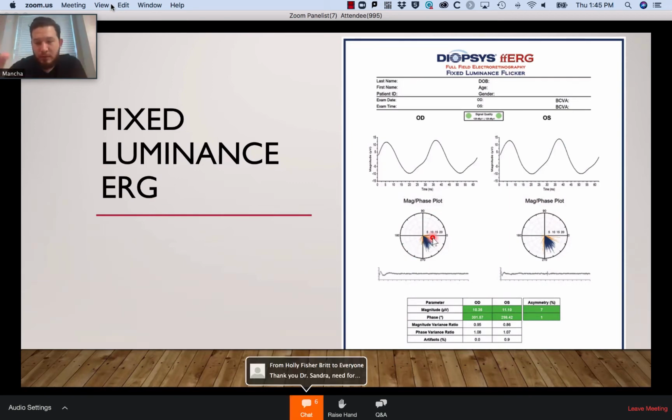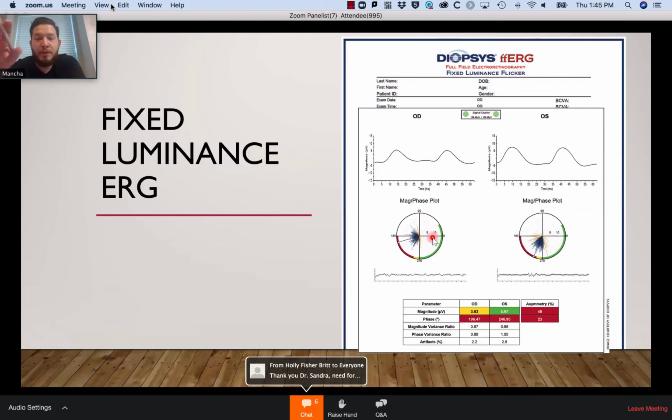And then, bear with me with my very limited computer skills, I'm going to try to overlay another image. This one's going to represent something that you would find on an unhealthy retina that's showing some kind of dysfunction. In this case, we'll just say it's diabetic retinopathy. The first thing that caught my eye was that we lost this beautiful sinusoidal waveform, and now there's just a weird disruption of that wave pattern, right? There's a decrease in amplitude, and the wave structure itself is no longer normal in both the right and the left eye. The right eye looks a little bit worse.